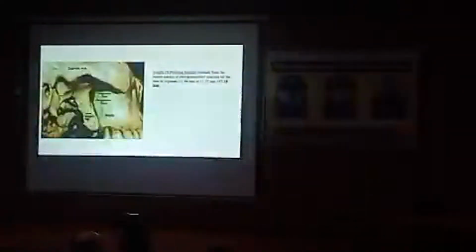So that is why 27 is present, but the safe zone is 13 mm. This is the key point to note: even if we have 27 mm length available, we will not think that we can put n number of implants, but 13 mm of height is the safe zone.